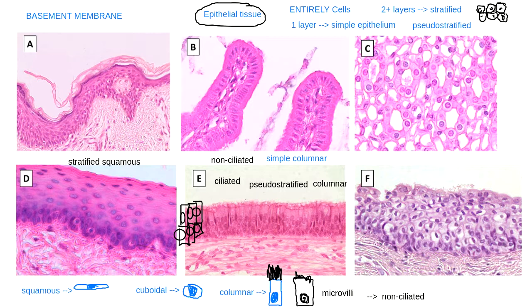Okay, yep, so when we talk about keratinized, we've got a lot of keratin. That's a protein you're going to learn about in this week's lecture lesson. When a cell fills up with keratin, it starts to die. And dead cells don't stay attached to the rest of the cells anymore, so they start to fall apart. When I'm looking at non-keratinized stratified squamous epithelium, my cells are still attached. They're even still alive in that outermost layer.